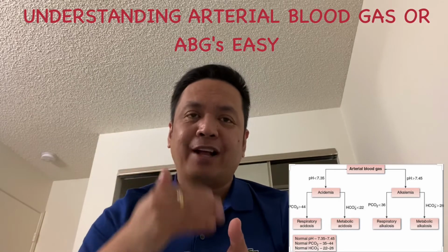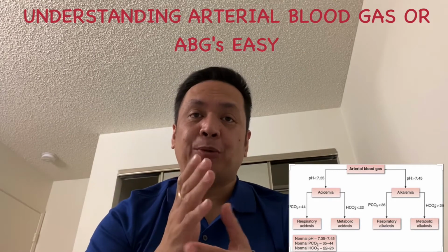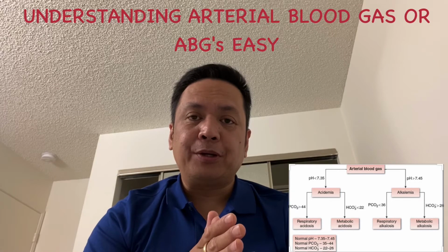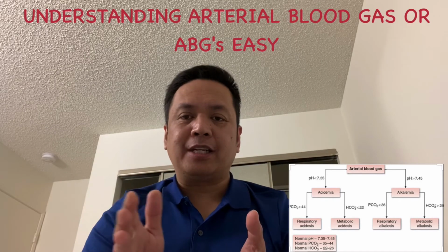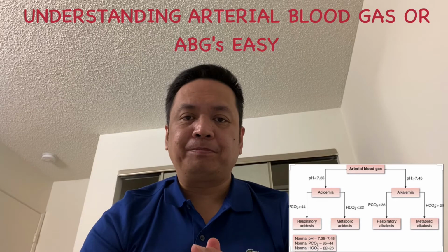And the next value finally is the bicarbonate ions, or HCO3 bicarbonate. This will tell you if the problem is related to metabolic changes in your patient and to the renal system.